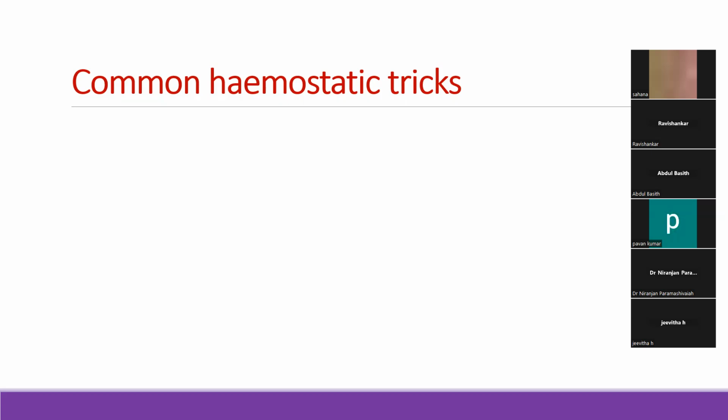With a Maryland, if we can precisely hold it, that would be relatively dangerous. We're talking about pressure. We're not talking about actually clipping or holding it. A gauze piece is definitely an option. Would you be able to put a whole gauze piece into the abdomen? What else would you have to do? We can put a whole gauze piece into the abdomen.